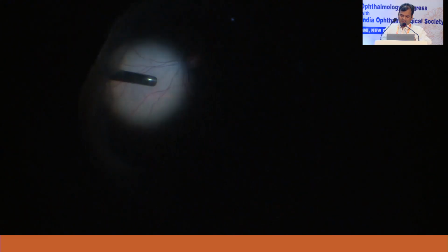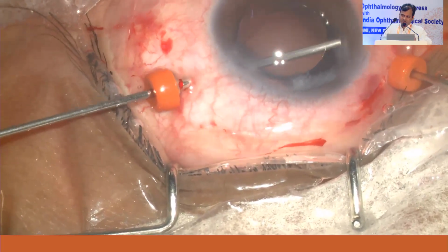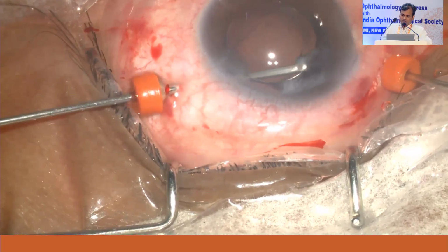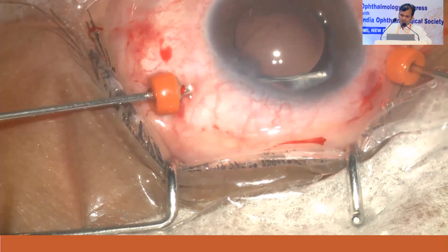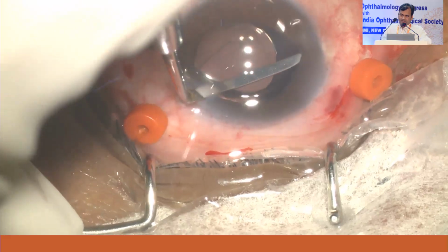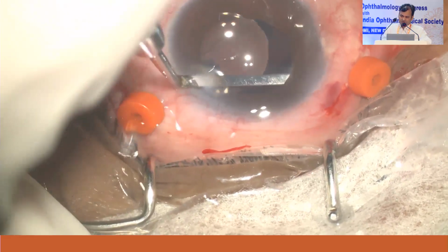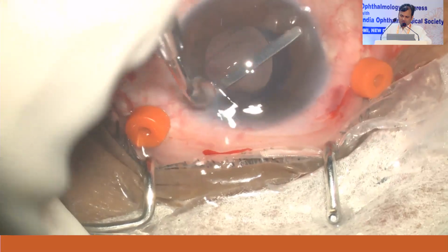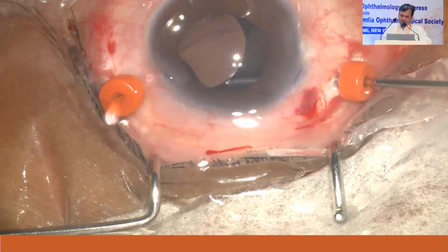and also go inside and see if any fragments are lying in the vitreous cavity. You just pull it or suck it with your vacuum, and then you cut it. You do not use the cutter near the iris or behind the iris. Always avoid that. Just pull it and keep it in your view so that you can avoid damaging the iris.